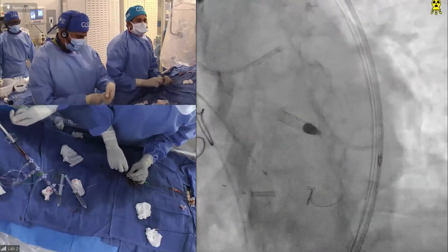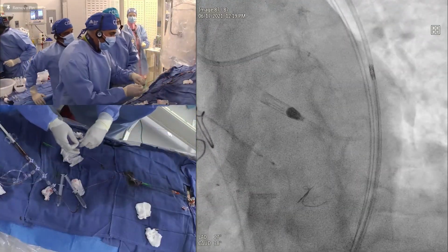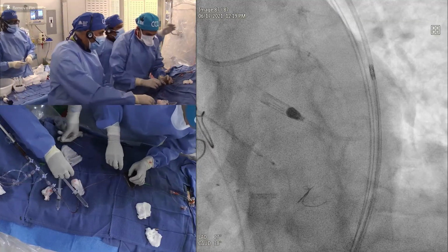But there is a little dissection. Yeah, there is a dissection. And there's wire bias with the dissection. When you already have wire bias, and then you want to go to a bigger burr, then there's risk of perforation. Yeah. And the audience, they ask us, let's see.